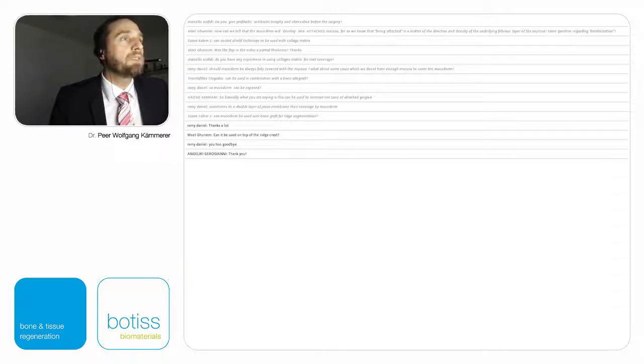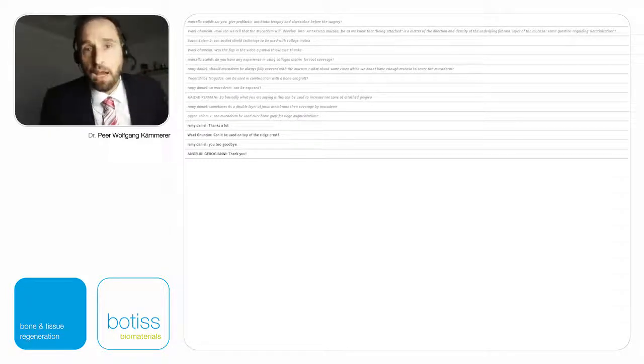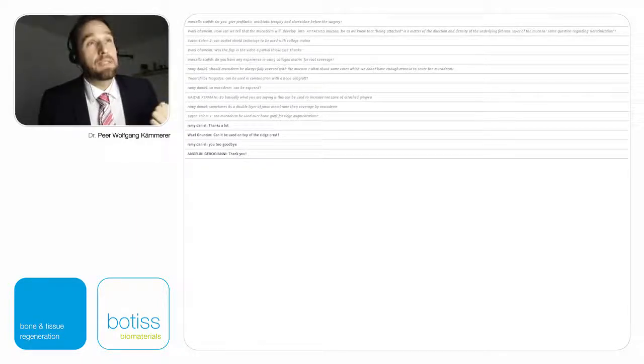The first question was, do you give prophylactic antibiotic therapy and chlorhexidine before this? Yes, we do. Half an hour before surgery, we start with antibiosis, and we do it for 5 days. Normally, we use amoxicillin plus clavulanic acid. It's in the morning and in the afternoon, and chlorhexidine mouth rinsing will be used 3 times a day. So this is of high importance, the cleaning procedures.